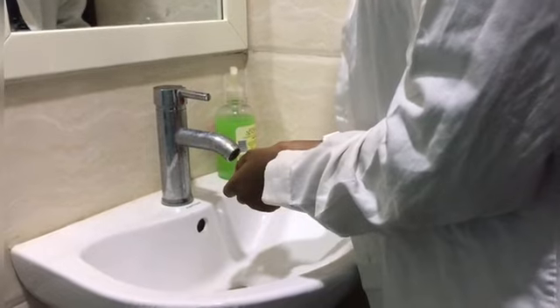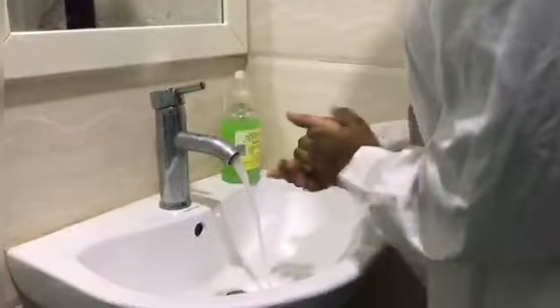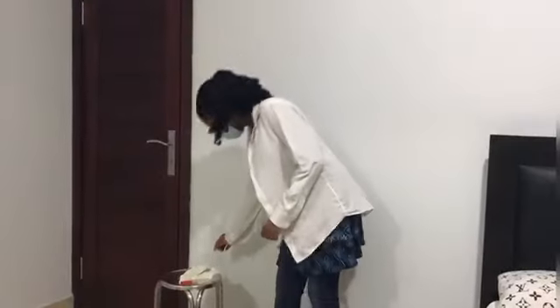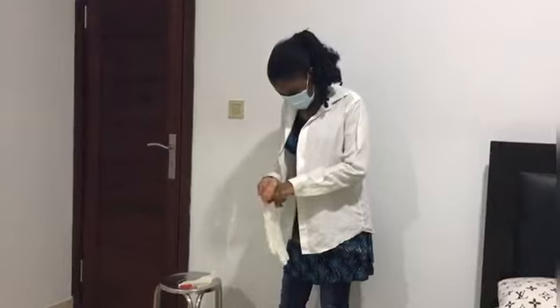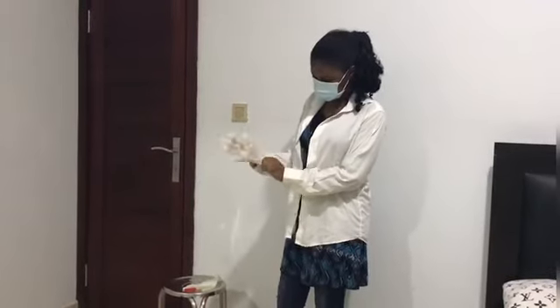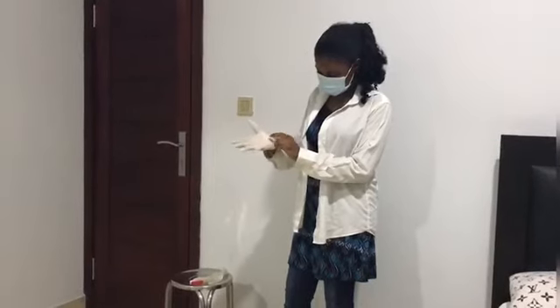The first step is to wash your hands properly and carefully with soap and clean water. This will help to limit the spread of contamination that might be gotten from fluid that might come out from your patient's mouth. Then, you should complete the hand hygiene process by putting on sterilized gloves. It is also important for you to clean the thermometer with an alcohol pad.